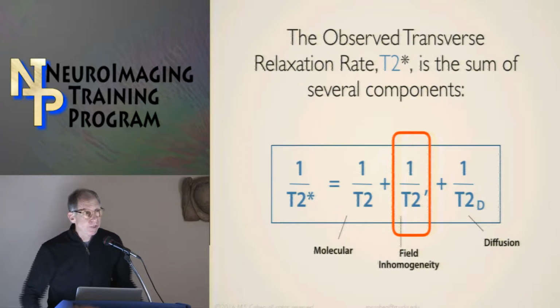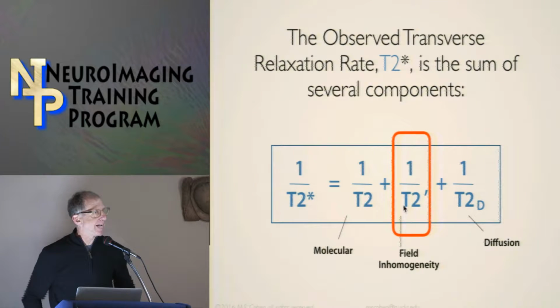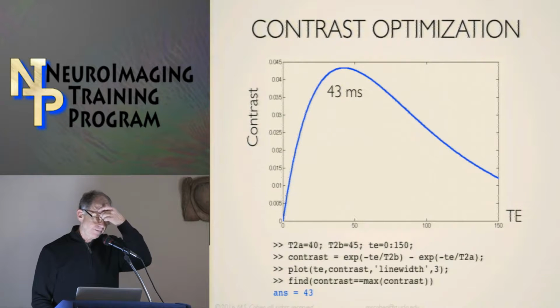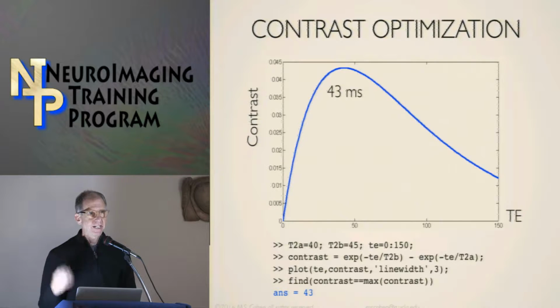the signal intensity equation relating to T2, you can see that because the relaxation characteristics essentially add as their inverse, the single T2-like effect which is shortest is going to dominate the observed relaxation rate. So when T2 prime is the shortest thing, which it typically is in human scanning, T2 prime dominates the rate. One of the effects of BOLD is to take the T2 prime and shorten it somewhat. And so if you want to look at the change in signal intensity as a function of T2 prime, you can calculate that according to the equation I showed you before, and this is the plot.